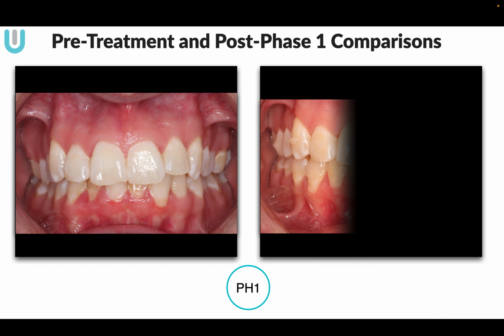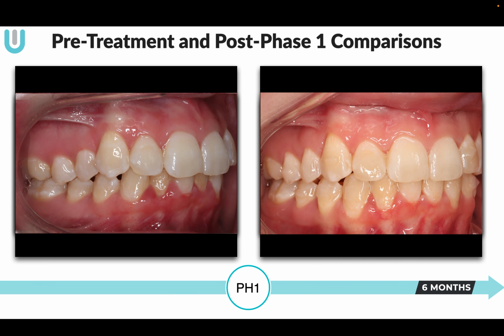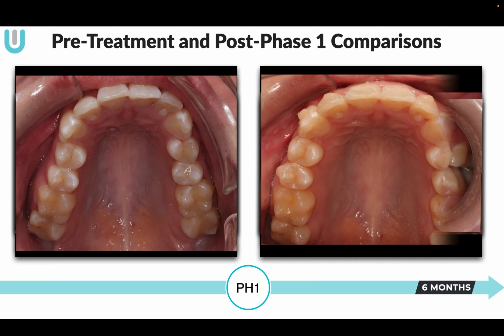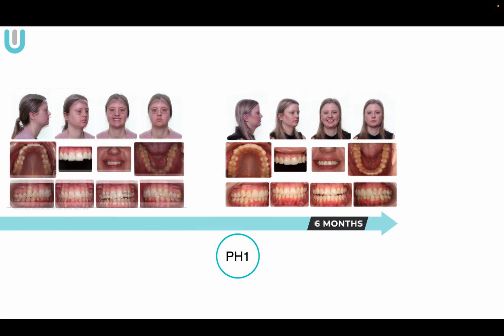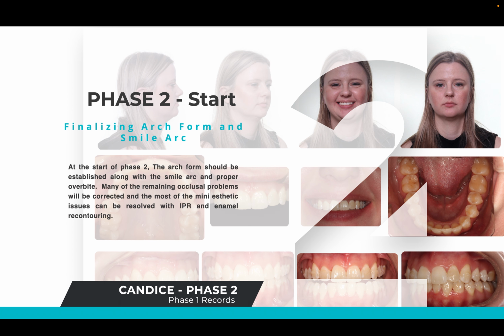If we go ahead and we look at what we see clinically, we can see that our objectives were met. We're able to control the teeth, get most of the goals of our treatment accomplished in that first phase, knowing that phase 2 and phase 3 are going to be shorter. So 5 months with a month wait. So we're at 6 months with a month wait. We're at 7. That's phase 1. So now what are our instructions for phase 2?